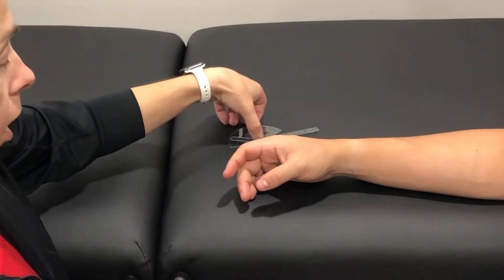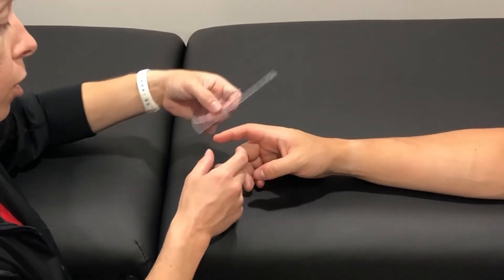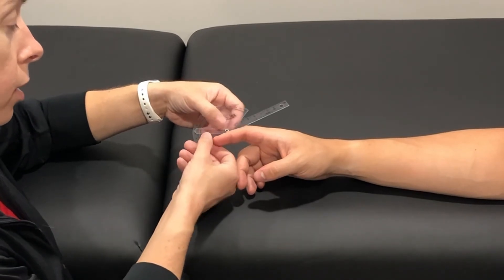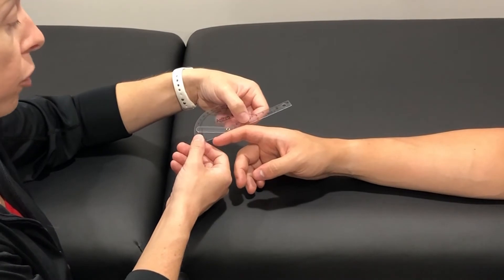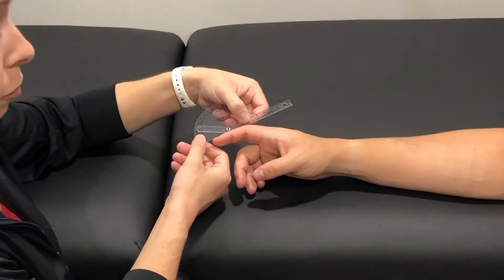Measuring active range of motion. I'll line my goniometer up with the fulcrum over the dorsal DIP joint. The stationary arm will be over the midline of the middle phalanx and the moving arm will be over the midline of the distal phalanx.